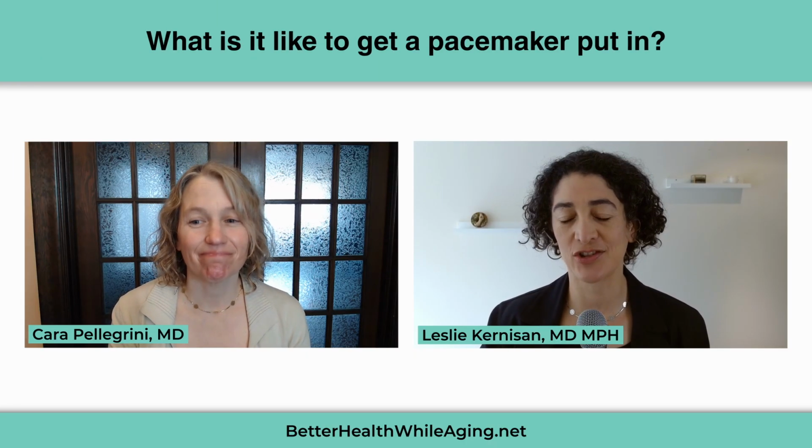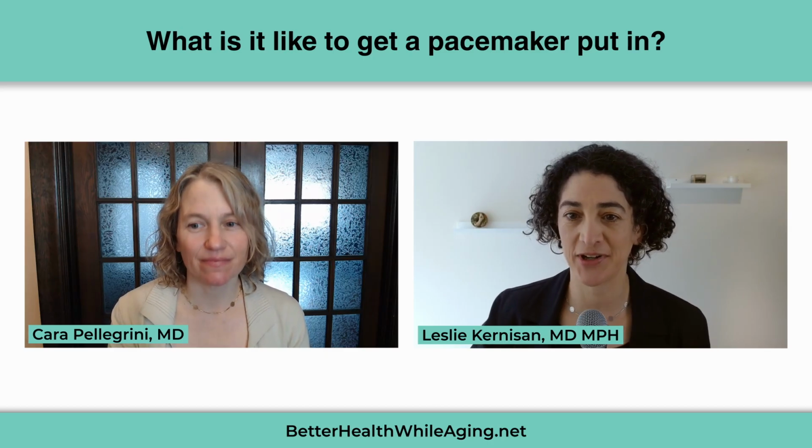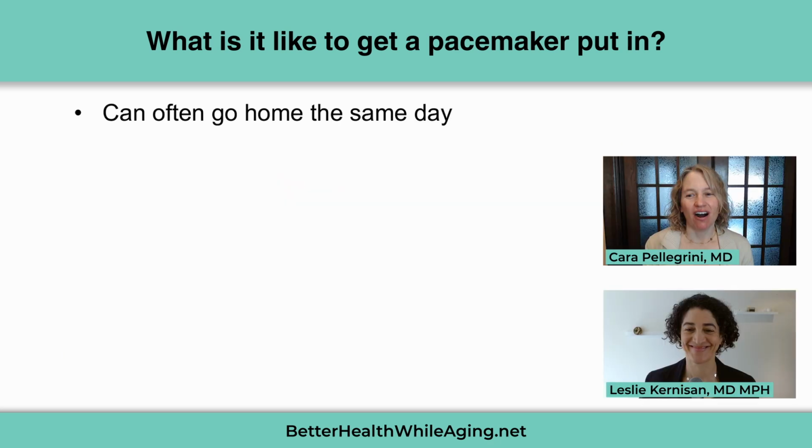Okay. Well, can you tell us now, what is it like to get a pacemaker put in? Yeah. So, hopefully not a terrible experience. Often people come in and have the device put in and go home the same day with a friend or a loved one to watch over them as they recover from the sedation that they had as part of the procedure.